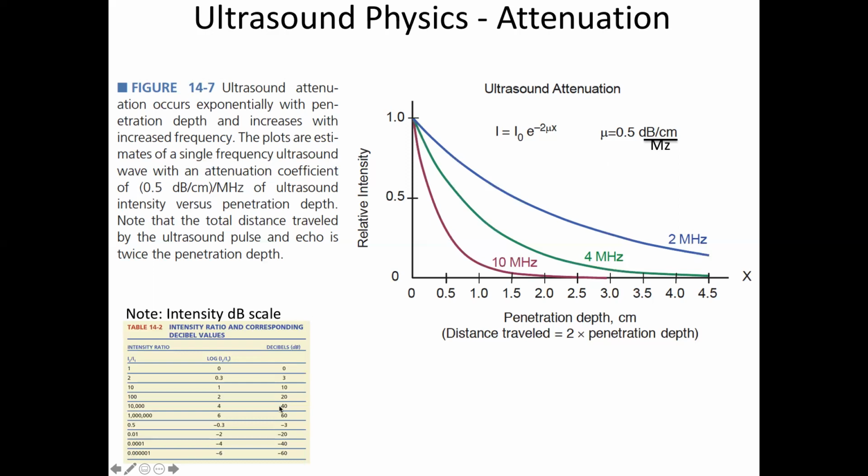And so you should know what decibels are, right? But everybody's in engineering, so I'm pretty sure you've come across it in other courses. But they put this chart in here, which is a good idea. It's just basically the log of the two intensities. And then, so you don't have to use decimal places, you just multiply by 10, and you get the dB of the intensities. So 60 dB is a factor of 1,000,000 reduction, right? And 3 dB is a factor of 2.